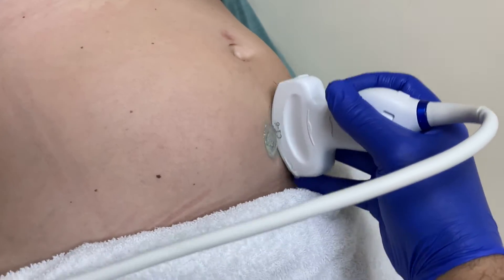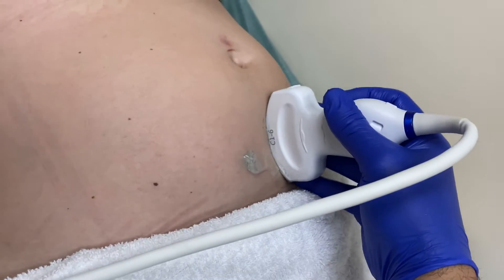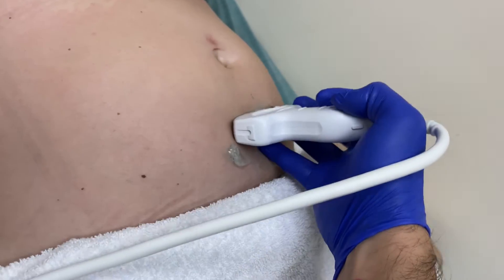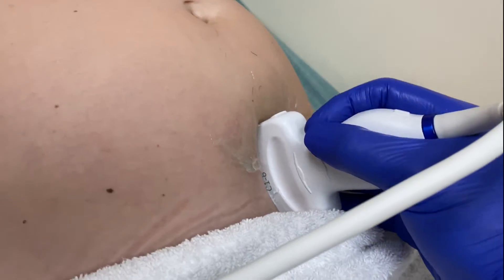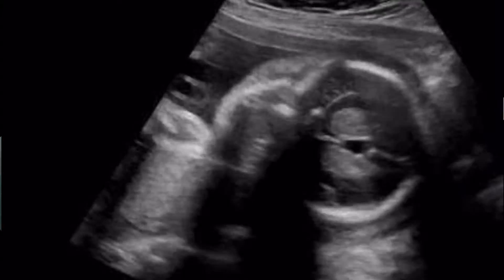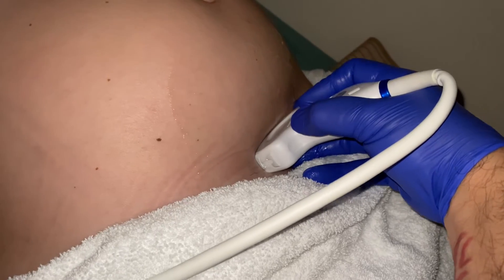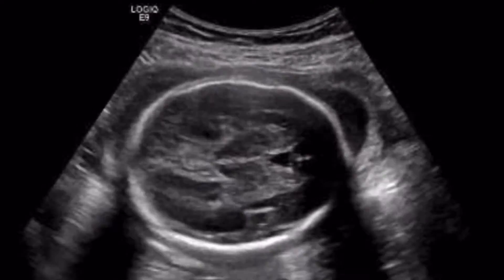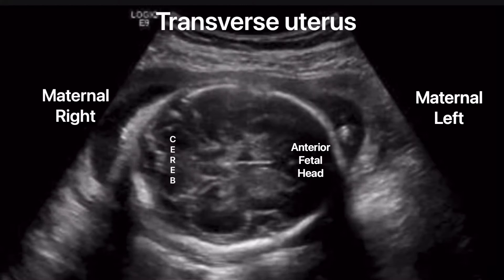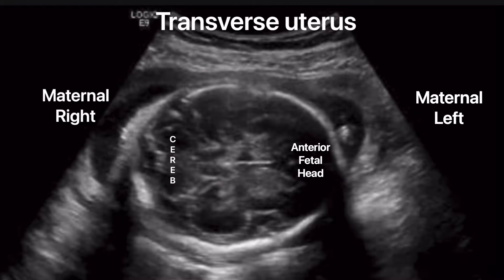Here you have the maternal abdomen sagittal or longitudinal, and the maternal abdomen transverse. For presentation, you want to come down here towards the symphysis pubis, and we know that this baby is vertex or cephalic. We'll go transverse down here where the baby's head is — and there's the head. Back here is the cerebellum to the left side of the screen, so the baby's face is to the right of the screen, which is the maternal left. So baby is head down, face maternal left.